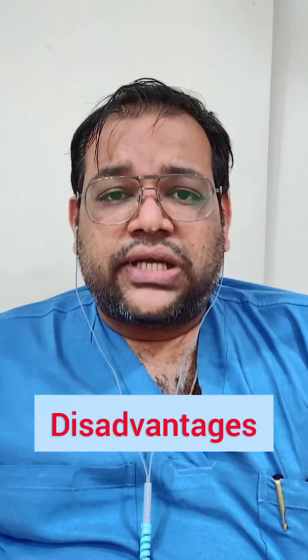Now what are the disadvantages? As you know, the patient has to generate a breath. So if the patient is not able to generate a breath for any reason, the ventilation will get affected. Patients sometimes struggle on pressure support because they are not comfortable, they are in pain, or there is hemodynamic instability. So you have to keep on monitoring the patient for that.